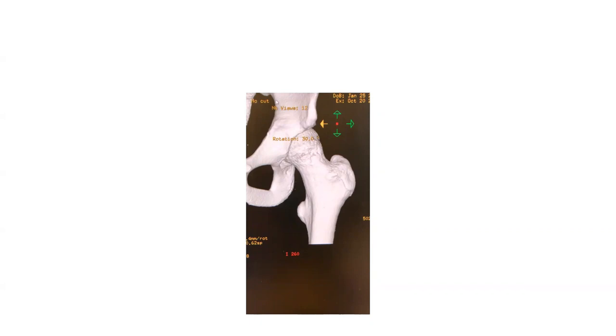Are we just going to do a CAT scan of the femur to look for a femoral neck fracture in everybody? No. But how many of your high energy traumas are going to have a CAT scan done of their abdomen and pelvis? A lot of them. So if you're going to scan the pelvis, why not make sure you include the femoral neck? It's almost always included. So our residents carefully look at that study to look for the additional information on that CAT scan.